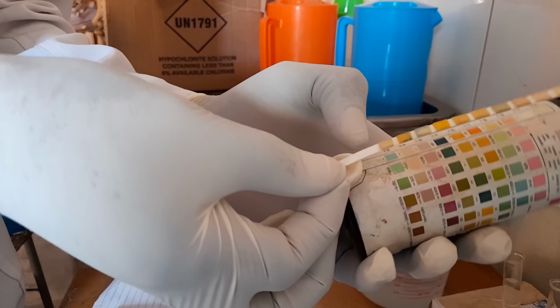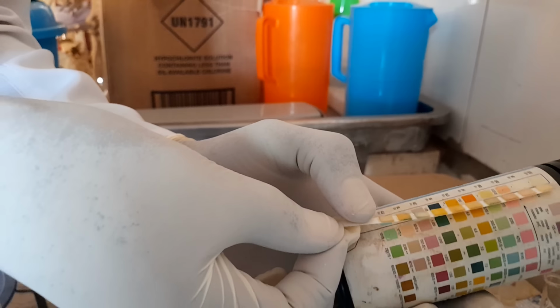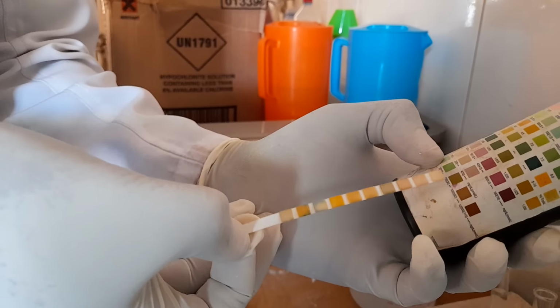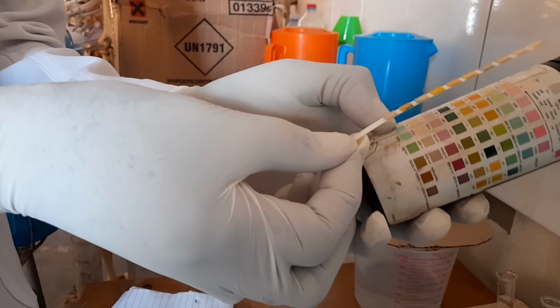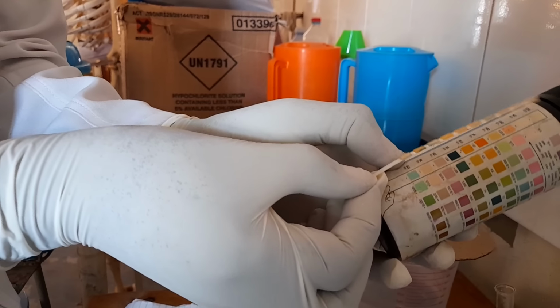If it has changed, the color for glucose in this mouth is supposed to be this blue. So if it has changed, you have to follow this and go. So in this case, it has changed to +2. This is +2 here. So meaning glucose, you're going to indicate +2. You tell the examiner glucose has gone to +2 or 2+.